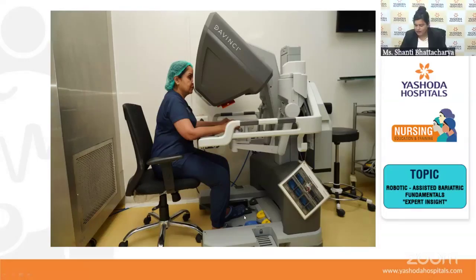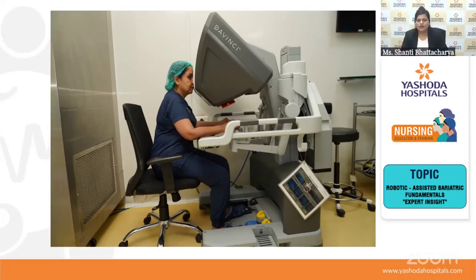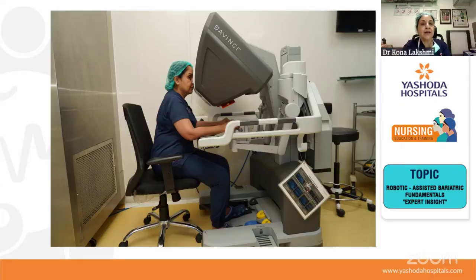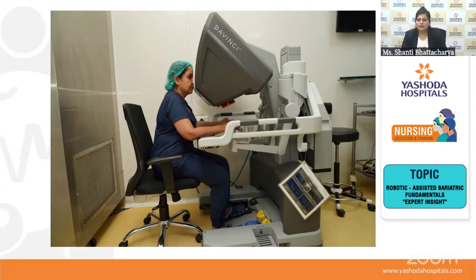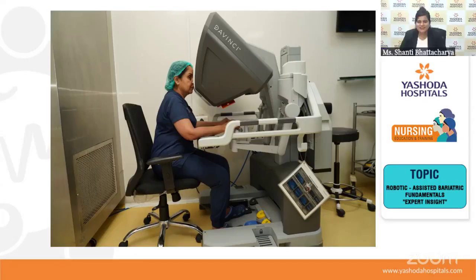And what does it do, ma'am? Monopolar is for cautery, for cutting. The nurses will not do any manual cauterization; everything is under my control. The nurse's duty is only handing the instruments, and the assistant surgeon will put the instruments in and take them out. There is no third party working on the patient. It is only centrally led by the surgeon. That's very wonderful.